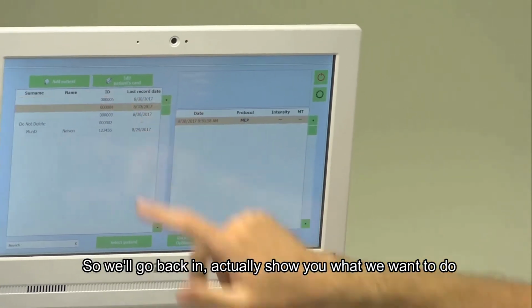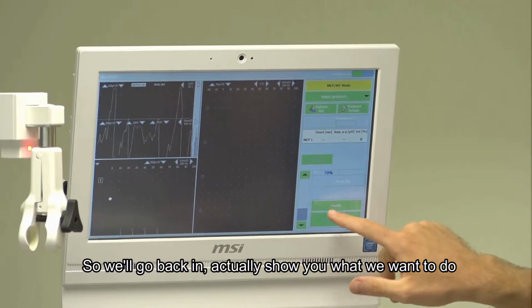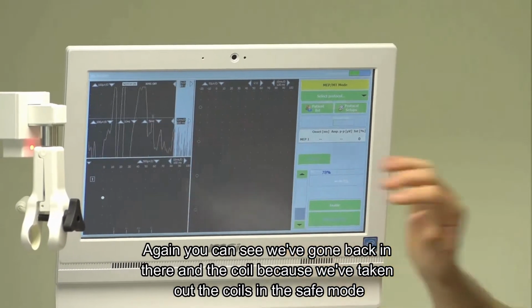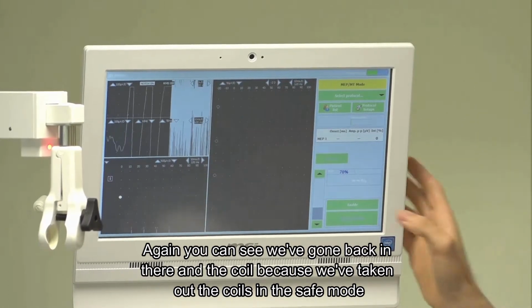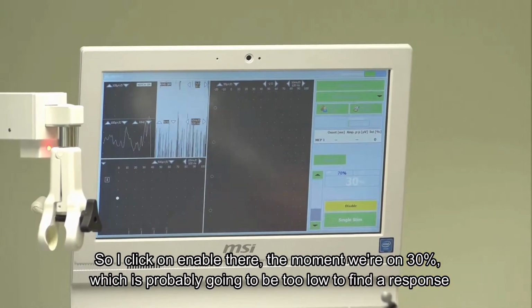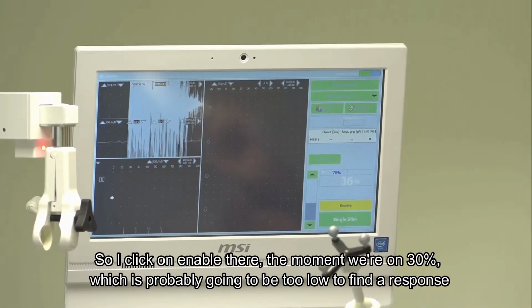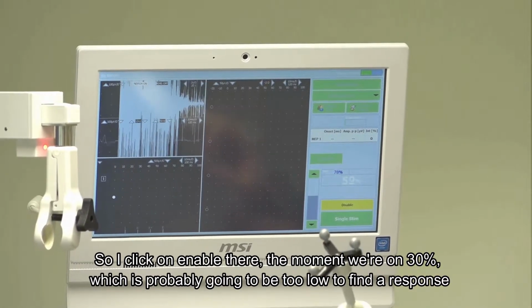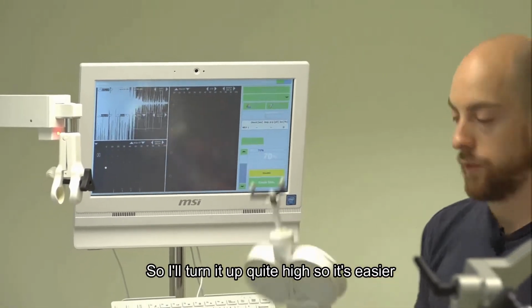So we'll go back in, and I'll actually show you what we want to do. Again, you can see we've gone back in there, and because we've taken out the coils in safe mode, I'm going to click on enable there. At the moment we're on 30%, which is probably going to be too low to find a response, so I'll turn it up quite high so it's easier.